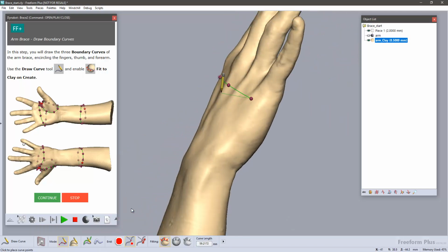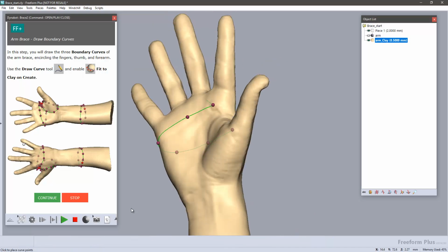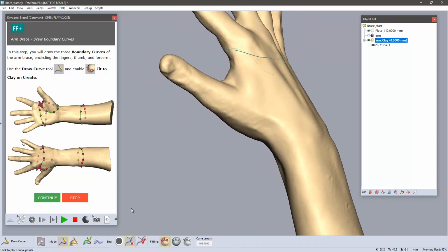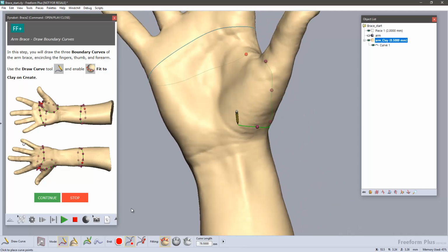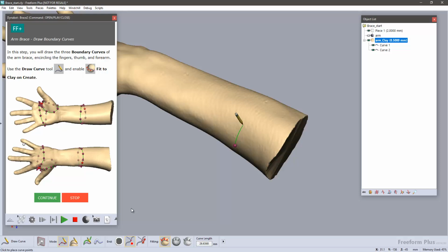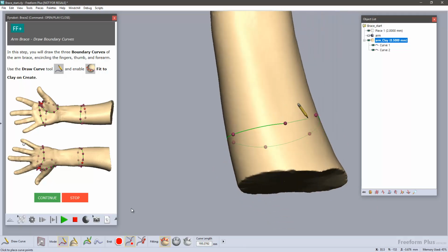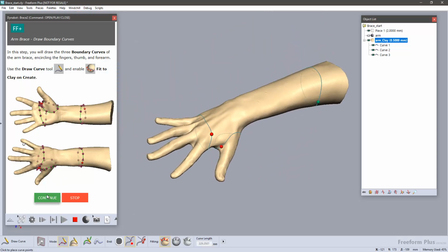I am clicking with my stylus. I touch the surface, move around, click to add a new point. And I don't have to add very many curves because the fitting does allow for a relative good amount of space. Close that and create one at the back of the forearm. Now that that is complete, I click Continue.